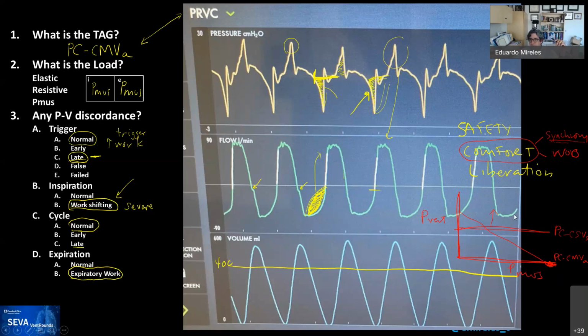That's a really good job, Emma. Now I see here. Absolutely, Mohammed. So why is the patient intubated?